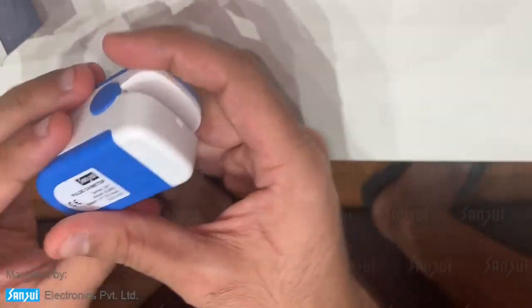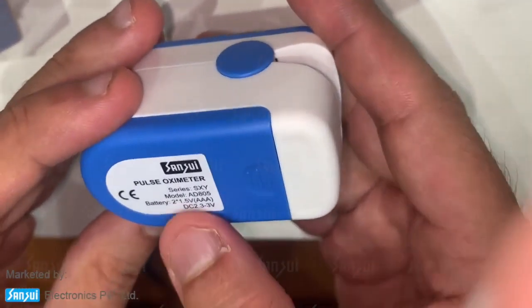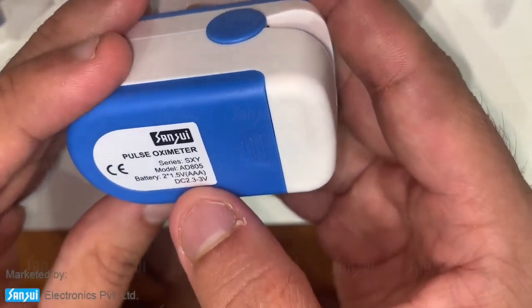You'll see 'Sansui' is written on the back. It's CE approved and it requires two regular standard AAA batteries.